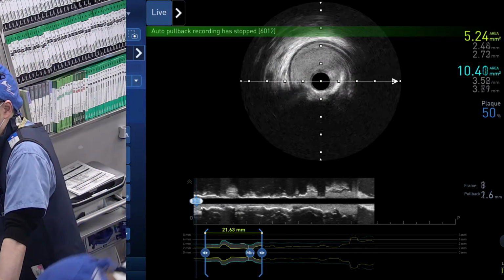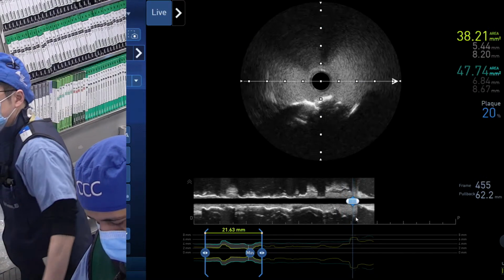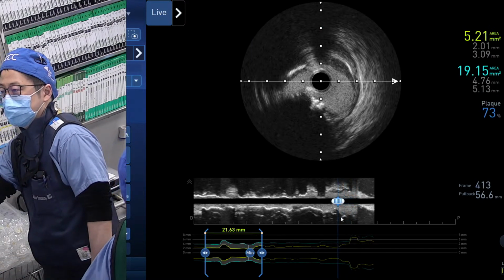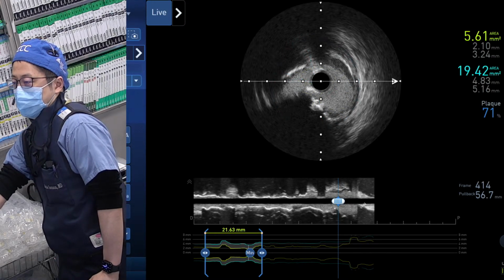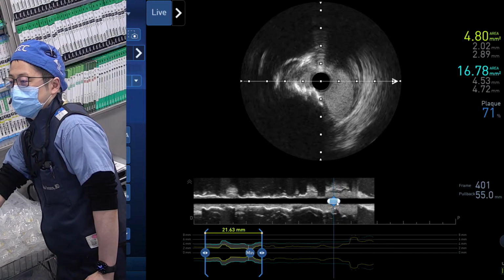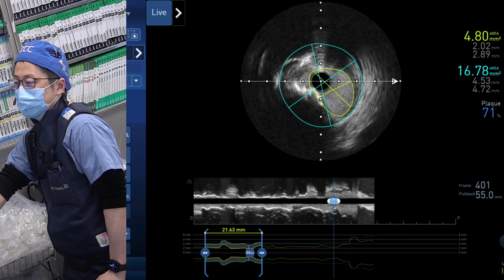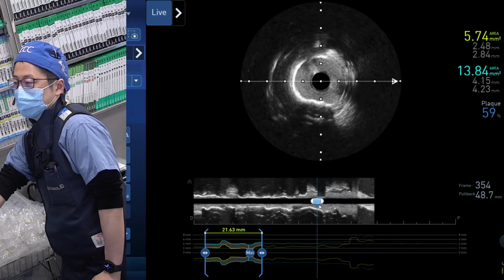I will stop it. Okay. So I will show you first the left main. This is the level of the aorta. So this is a proximal left main. Yeah, that's where it was getting caught in the first place. Yeah, the IVUS didn't cross maybe because of this nodule. Yeah, and a very tight area, 4.8, less than 6, even after the rotablator.